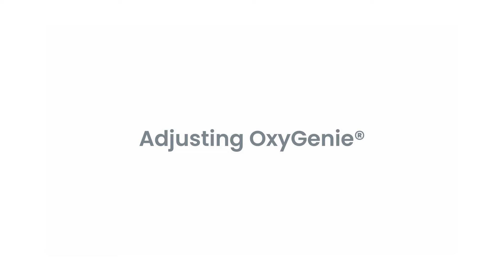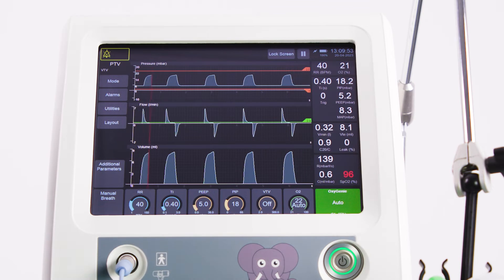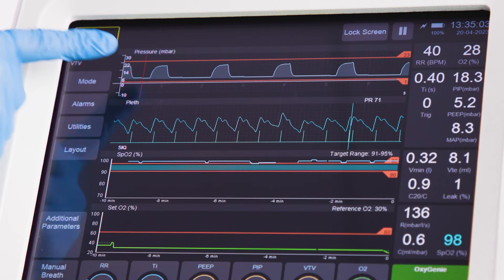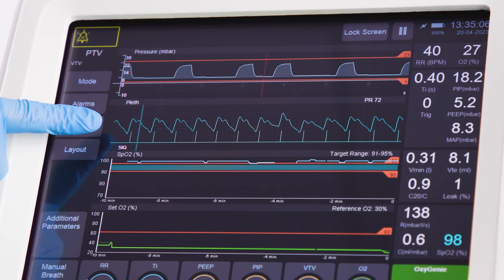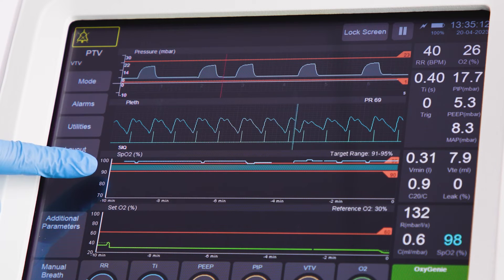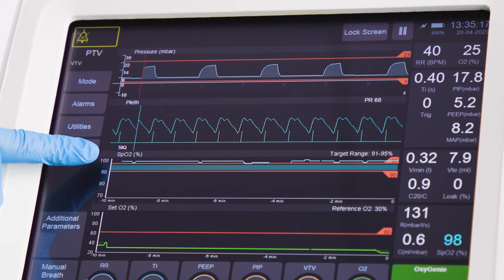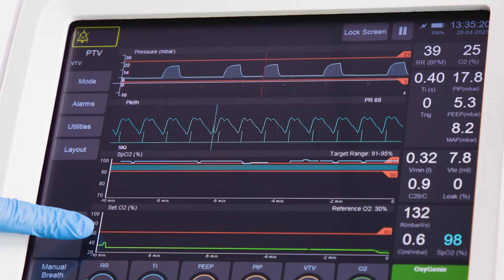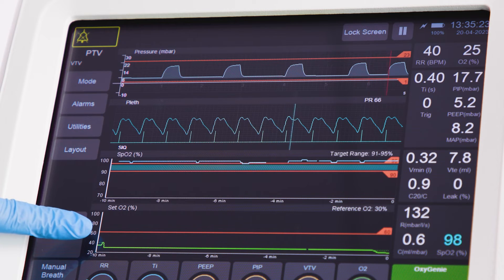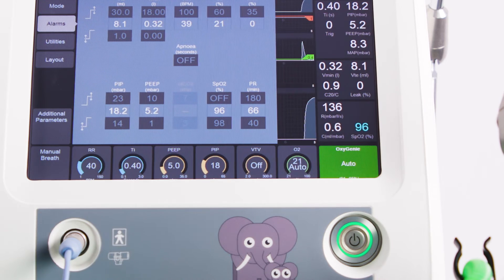Adjusting Oxygeni. The custom SpO2 screen displays four waveforms. One: the user-selected ventilation waveform. Two: the current SpO2 plethysmograph waveform with SIQ and pulse rate. Three: a fast trend of the SpO2 value and a band showing the current target SpO2 range. Four: a fast trend of the current O2 value with a reference O2 value as a dotted line. The reference O2 value is updated every 30 minutes and is based on the last 60 minutes average.